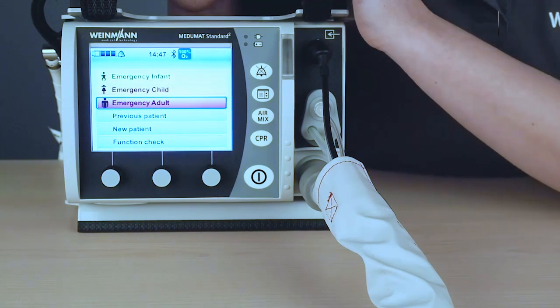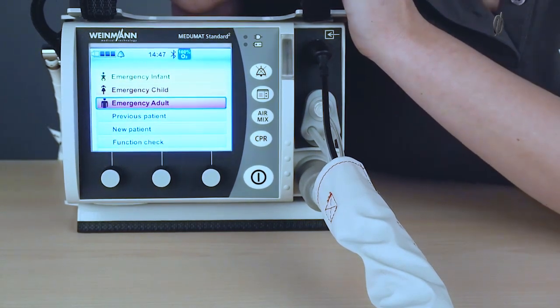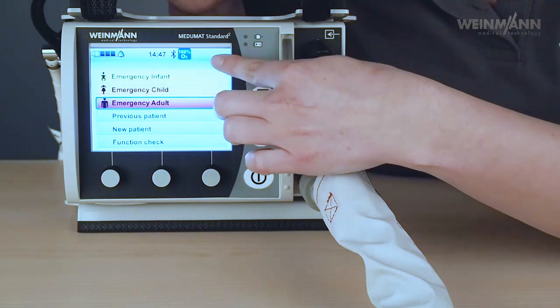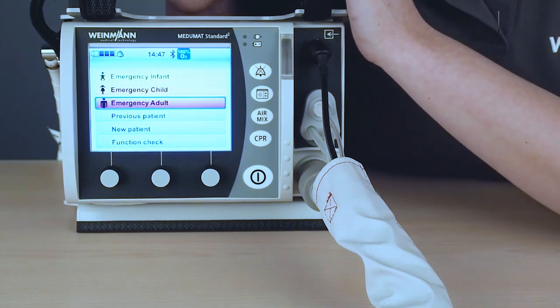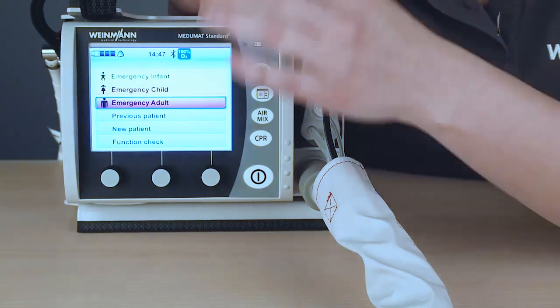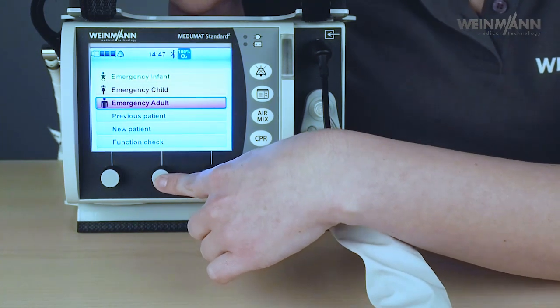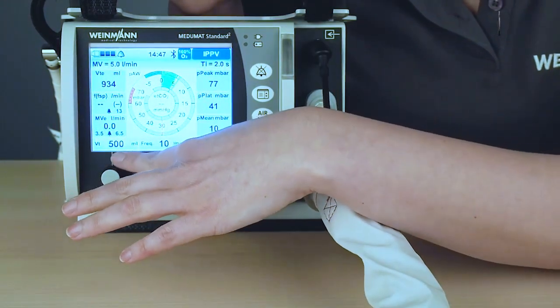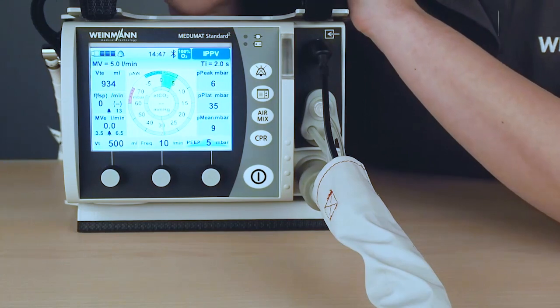So now I would like to show you how to work with the device and how to start a ventilation. For starting ventilation, you have different options. The easiest option is via the emergency modes. So here you have 3 different emergency modes for infants, child and adults. And these modes are preset, so they're pre-configured settings. And with only one click on one of those buttons, you can start an emergency ventilation. In this case, a volume-controlled IPPV ventilation. You see here the settings for the adults are 500 milliliters in tidal volume and a ventilation frequency of 10. So very easy, very quick.